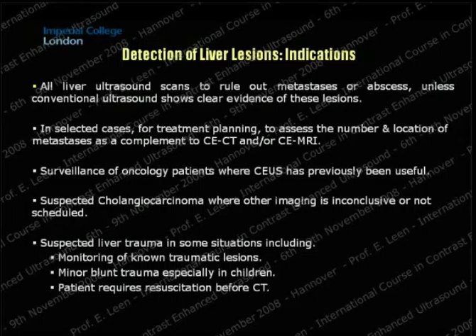And I guess there are several scenarios to that, because remember, if, for example, you're trying to do an RF ablation on the tumors, and these scans have been done weeks before, and you want a more updated stage of the liver, you really want to use contrast to assess the true extent of the disease in the liver parenchyma.